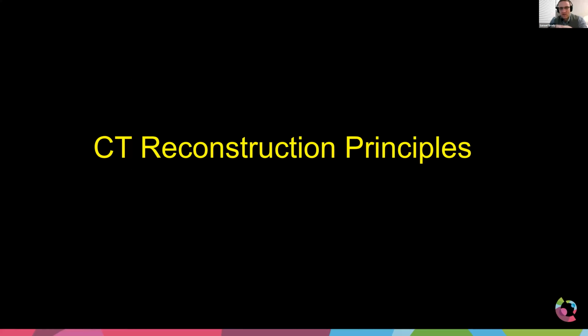And so we mentioned all the way at the very beginning, and actually talked about this a lot more last week, there are certain reconstruction principles and certain acquisition parameters that we can optimize that have no effect on radiation dose. And actually, forgive me, I said that wrong. We can affect image quality without changing the radiation dose to the body. So we can make a very big positive change without needing to worry about overdosing or underdosing our patients.